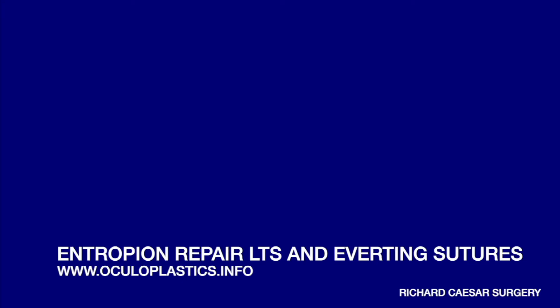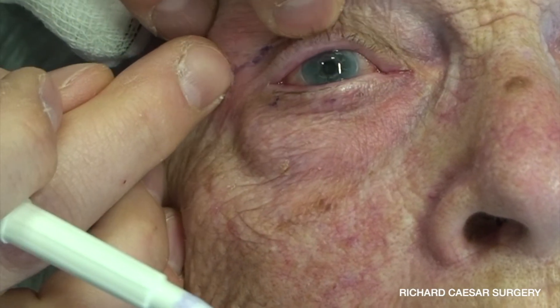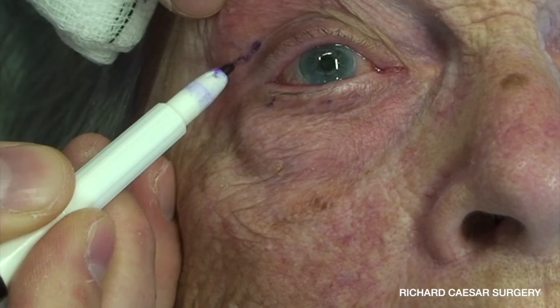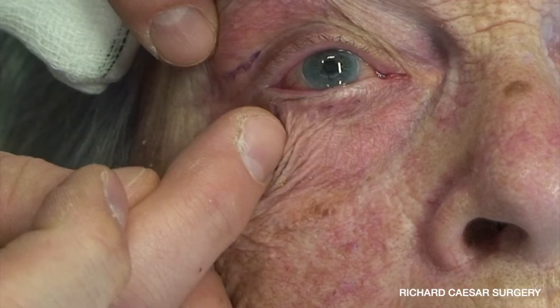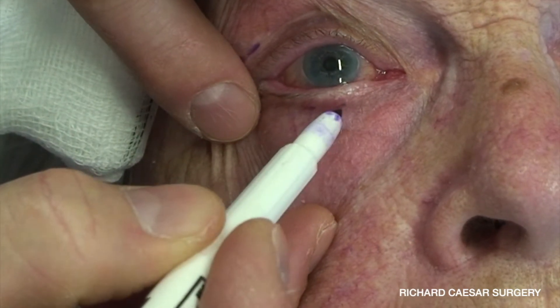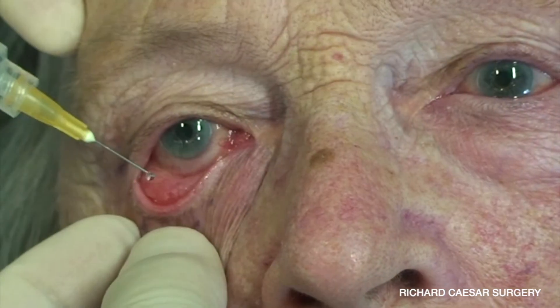Hi, this is Rick Caesar from oculoplastics.info. In this video, this is an elegant technique for entropion repair which uses a minimum number of skin sutures at the end. The markings are a lateral upper lid skin crease, essentially for a canthopexy incision, but in fact this is a modified tarsal strip that I'm going to perform, and then there are two marks here for the exit points for the everting sutures.